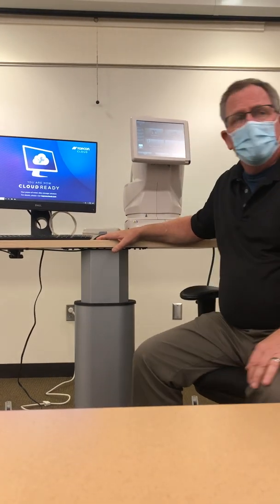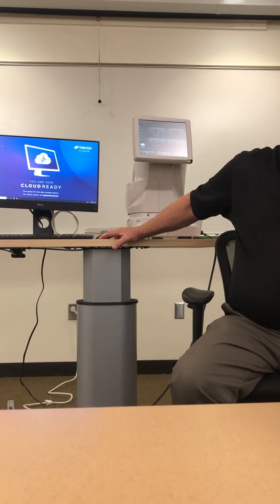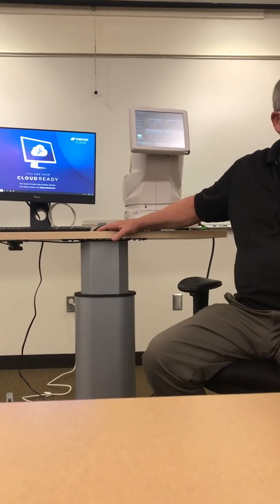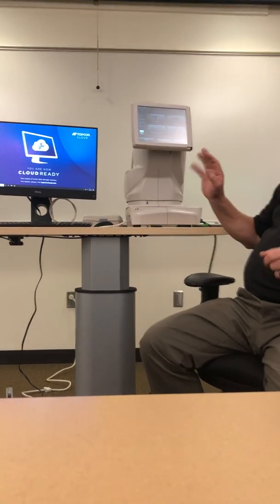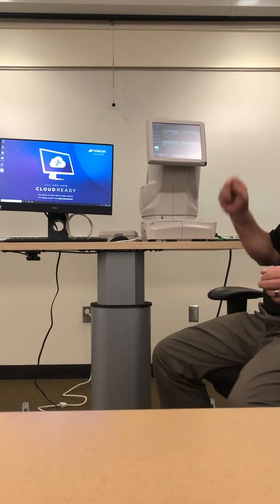What happens if you accidentally do it the other way? Then you have to call service in, and it'll probably ruin the instrument. You had me going for a sec there. No, you might just get an error, camera not ready or something like that. And to shut it down, it doesn't matter. You can just shut it off.